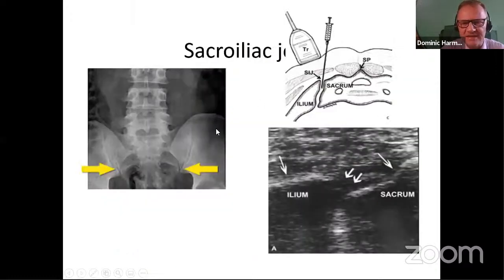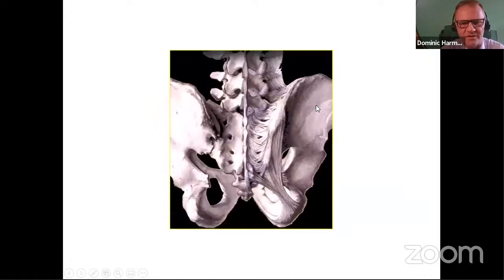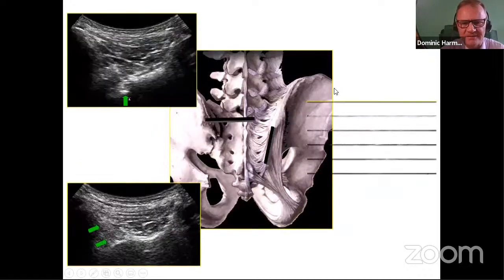Now, here's a skeleton. Here is an image here. Now, I've written several papers on ultrasound for the sacroiliac joint, but here's an image here, and it shows a needle coming from medial. And in fact, I'd have to say, if you're doing an intra-articular joint injection, I disagree. You actually can't do it that way. It has to be more out of plane. And I'll show you now further. So again, we're back to the skeleton, and we'll show you a bit more detailed images here.